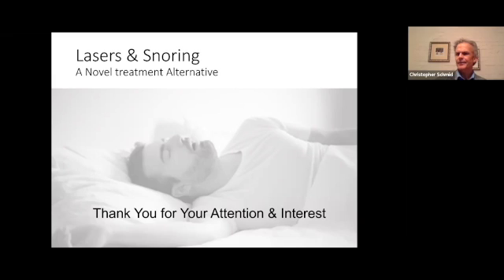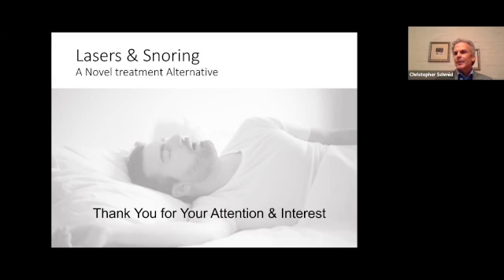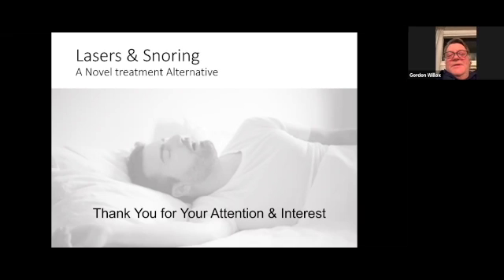Thank you. In terms of affordability, is there a laser in existence that allows you to turn a dial and get the benefit of different wavelengths for different procedures? Kind of like turn the dial to 5 and get French fries sort of thing? Yeah, we wish there was. The only thing you can't change is the wavelength. But there is a whole plethora of procedures you can perform with these devices over and above snoring, which is what I tried to show in the last couple of slides. Pretty much a good 95% of the procedures can be done with this carbon dioxide laser. So it's pretty multidisciplinary.